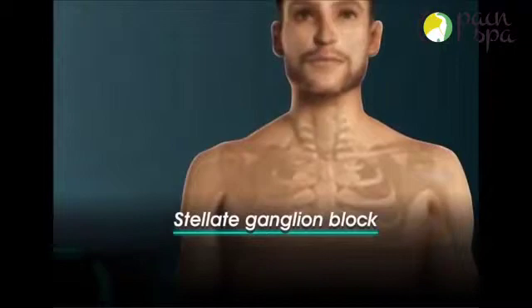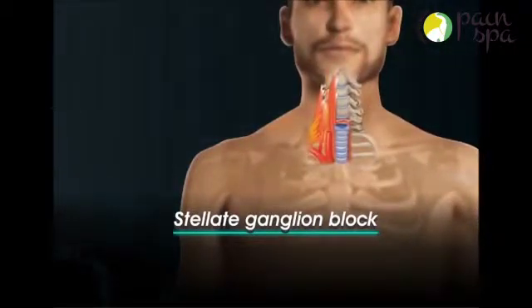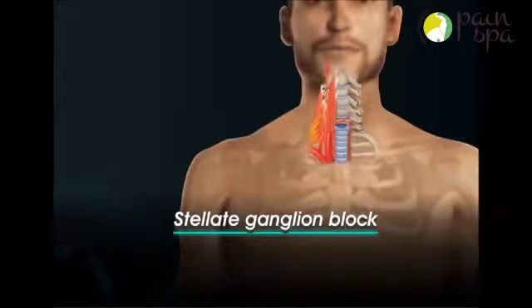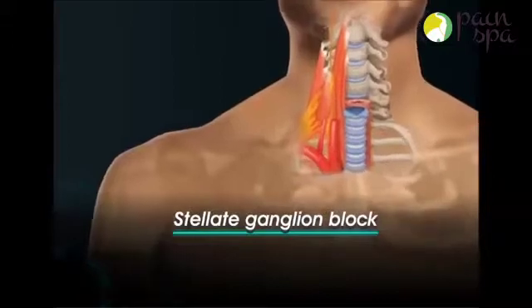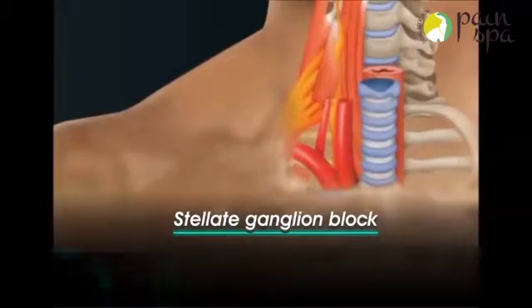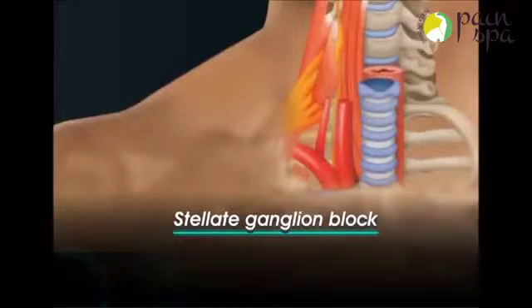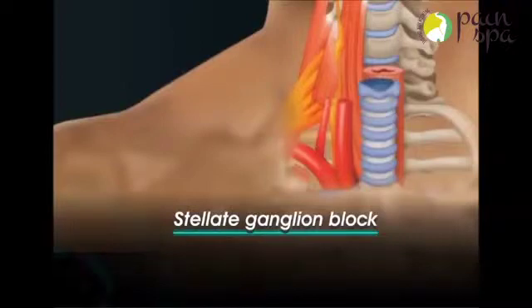Stellate Ganglion Block is an injection used to diagnose or treat pain arising from sympathetic nerves. It is used to treat conditions like complex regional pain syndrome, shingles, phantom limb pain, and post-traumatic stress disorder. The stellate ganglion is a group of nerves located at the front of the neck.